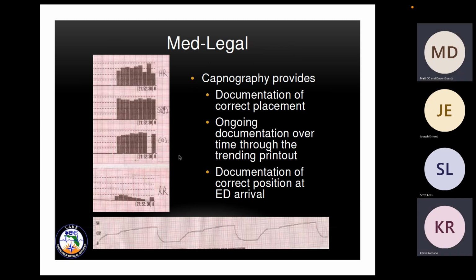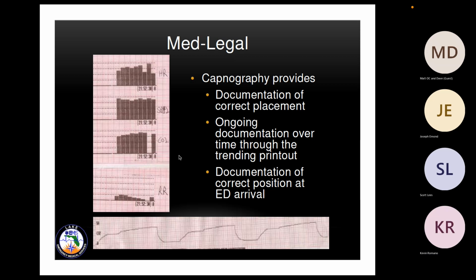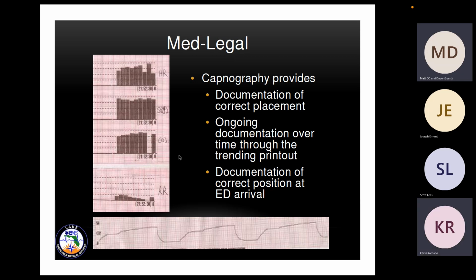Kevin? Yes, Dave. That waveform is recorded on the monitor. Is that a continuous one, or does it only come up and get noted when we have our vital signs taken every 5 or 10 or 15 minutes? So it's supposed to be continuous. If you go to the Zoll Cloud, it actually takes in a lot of info. It's what your service has programmed to upload to your report. Okay. So that's why we have to push snapshot for our EKGs, because those are the ones that it will upload. Right. You push it for the 4 leads. If you do a 12 lead, it automatically does it.